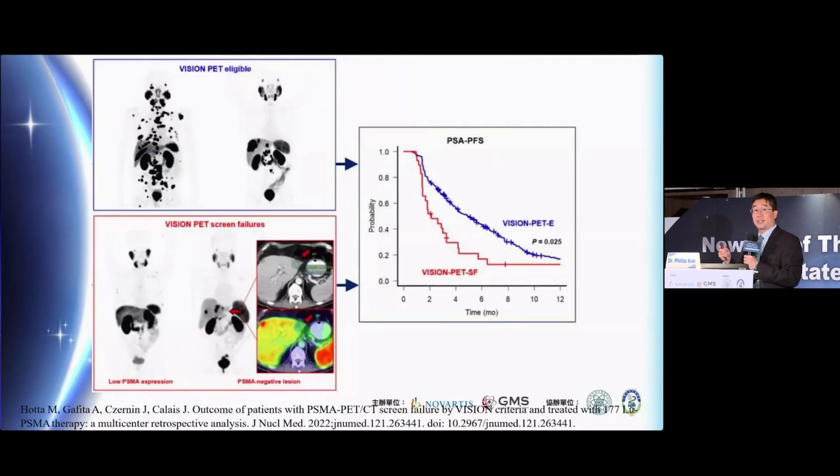Now, since these patients who were excluded didn't get treatment, and these PSMA PET criteria had never been used in any prospective trial, period, we actually didn't know how these excluded patients were going to do. But I knew that data sets would be retrospectively analyzed, and I want to thank the group out of UCLA for the first ones to publish this.